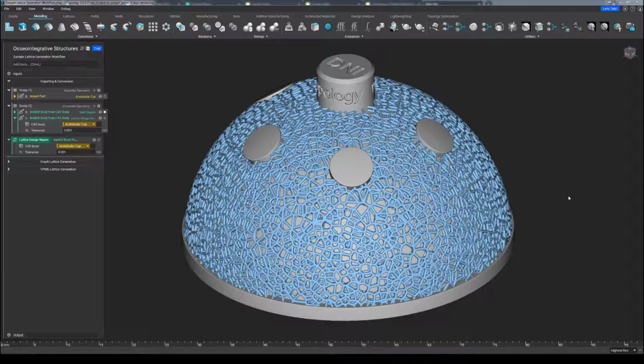For those of you not too familiar with custom blocks, a good way to think about them is to consider them as a compact or compartmentalized set of blocks. Custom blocks have a variety of uses, but one of their most common uses is to take a handful of complex or non-intuitive blocks and combine them in such a way so that all the complexity is hidden and only what is important becomes available to the user. The biggest benefit this provides is the ability to take a really long or complicated workflow that would normally use a lot of blocks and condense it down to just one or two.